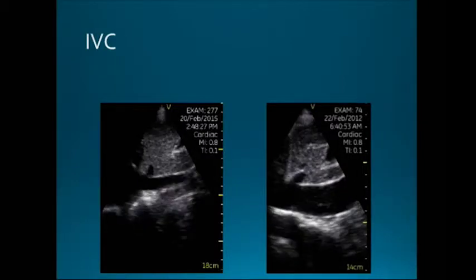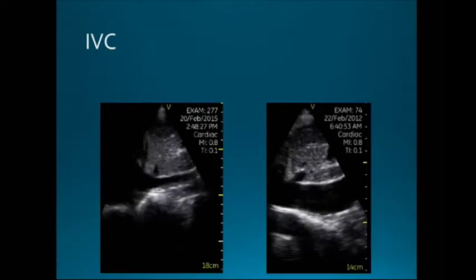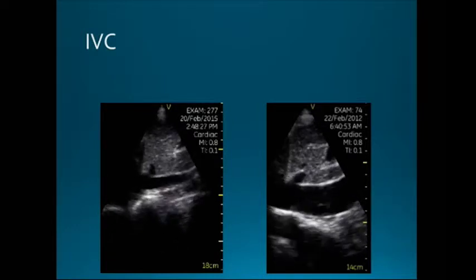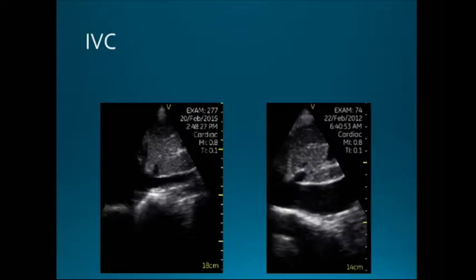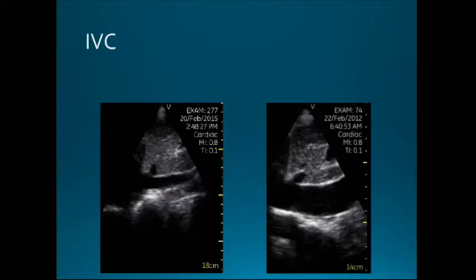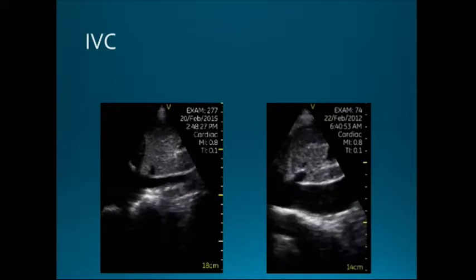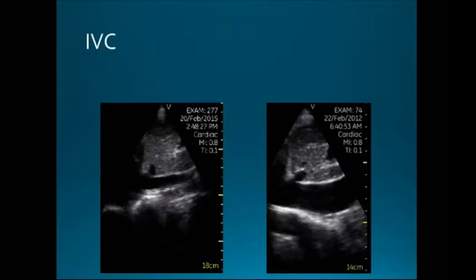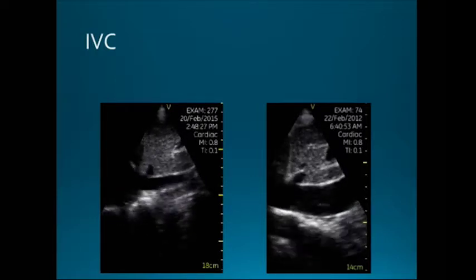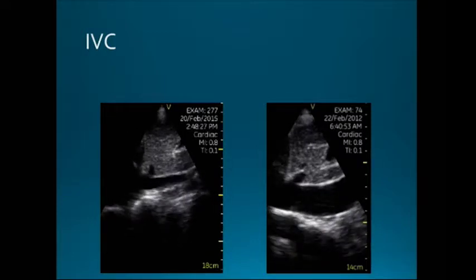And so looking at that inferior vena cava, this is the liver, and remember we talked about looking at a tube in longitudinal fashion, so the ultrasound probe is here, slicing the inferior vena cava long ways. And this is right as it dumps into the heart, which is up in here. If you see the tube here, it's normal in size, and when the person takes a little sniff, it has some nice respiratory variation. Here, this IVC looks like a giant whale's mouth. It's going to swallow somebody up, and it doesn't move. It's like a lead pipe. It doesn't collapse at all with respiratory variation.